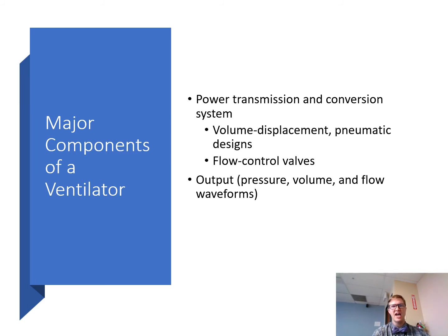So an appreciation of how volume and flow controllers operate requires an understanding of compressors, also known as blowers, right? Compressors reduce internal volumes. A compressor compresses, it reduces, it makes something smaller. So a compressor reduces internal volumes within the ventilator to generate the positive pressure required to deliver the gas to the patient. It's going to compress the gas, make it smaller, so it can deliver the breath to the patient. It creates that positive pressure.